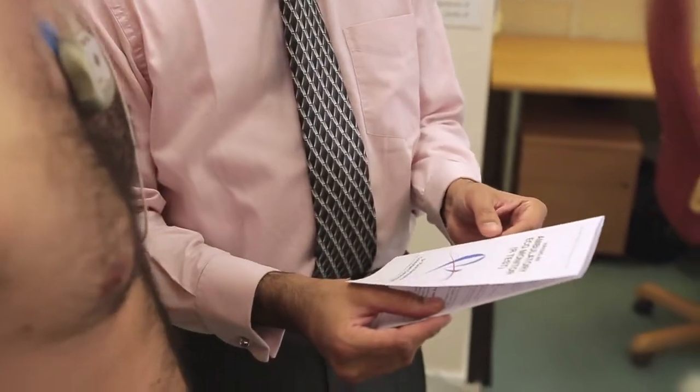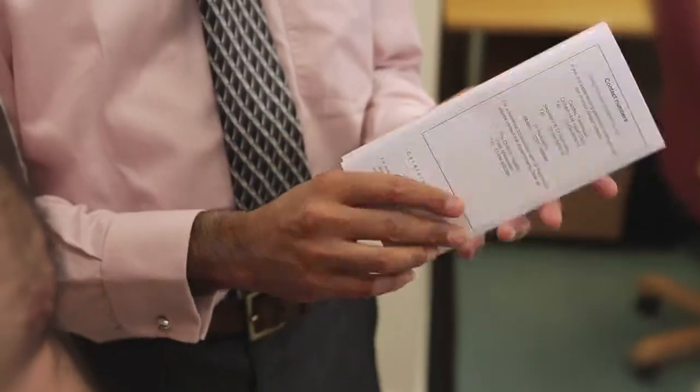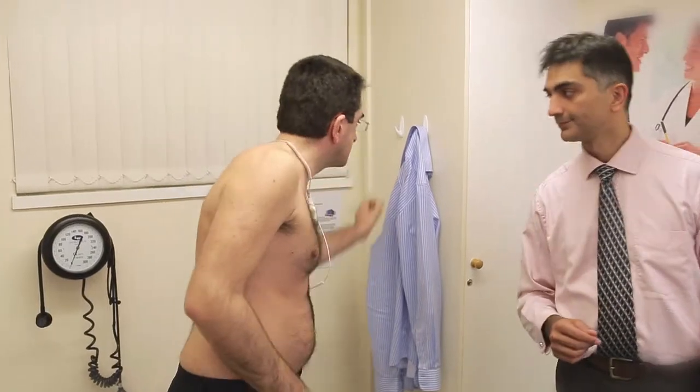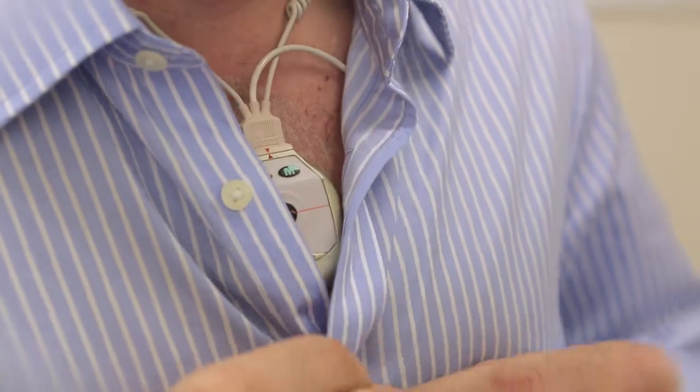The monitor is constantly recording with a time stamp on it, and so as long as the patient tells us when they get symptoms we can always go back and see what was recorded at the time. The monitor that we use here in the clinic also has a button that the patients can press exactly when they have symptoms, so it makes it easier to look back through the recording and find out exactly what the heart rhythm was doing.